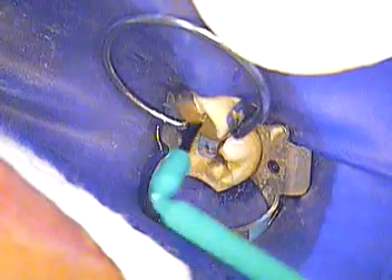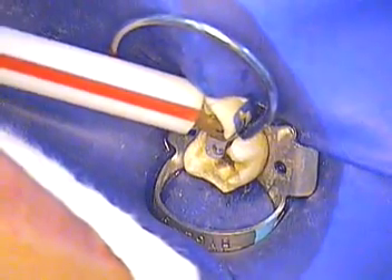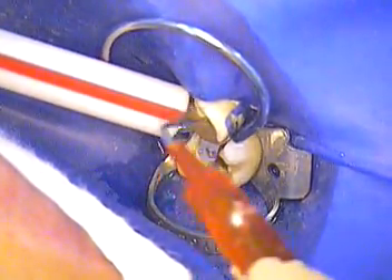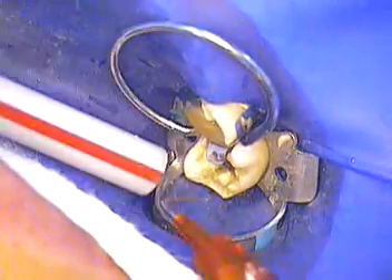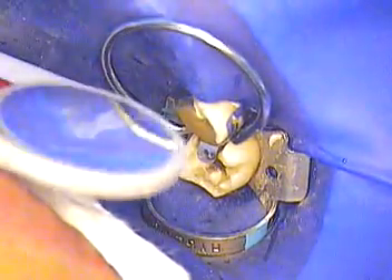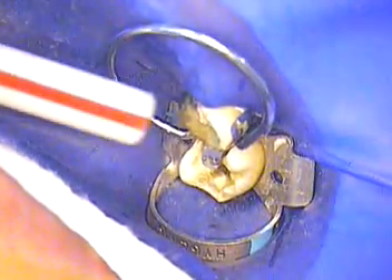That's the last coat. I'm going to use the air syringe — a modified air syringe with no water going to it. Suction that dam back there and get rid of that saliva — see that little bit of saliva that comes through. We took the sealer off to get the clamp on the tooth, so I have to keep being wary. That's a nice shiny surface. This is the bonding agent. We'll suction off the bonding agent and just keep it right there.